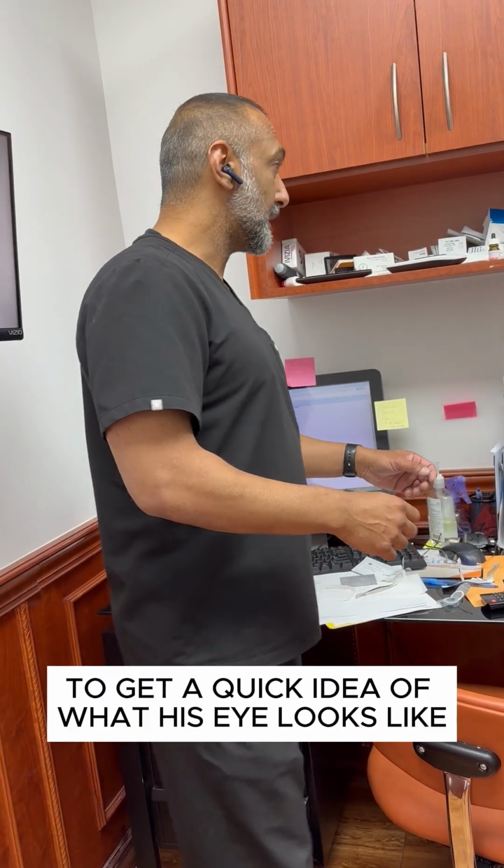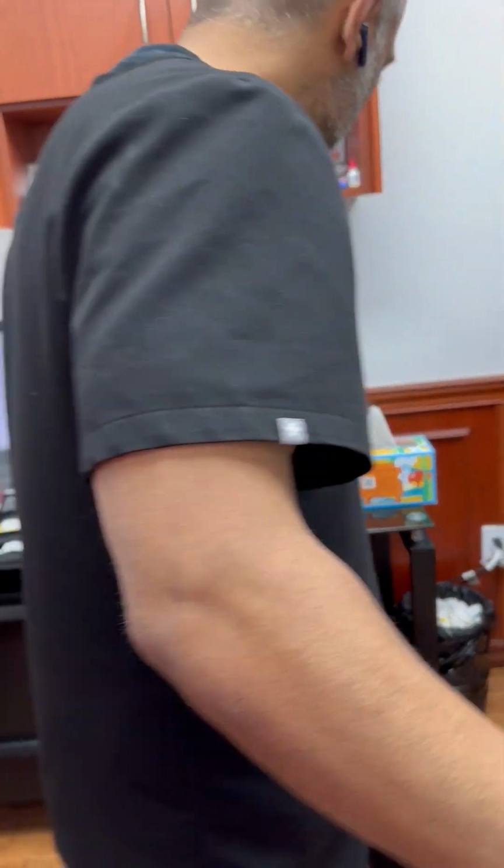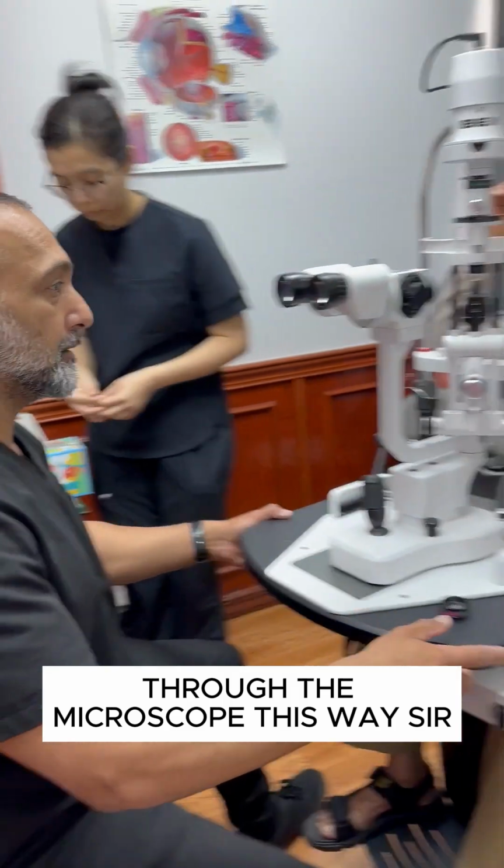To get a quick idea of what his eye looks like right now, let's go ahead and take a quick look through the microscope. Come this way, sir.